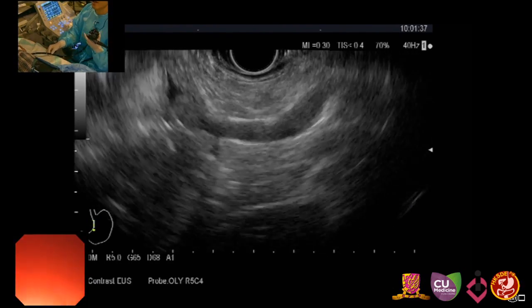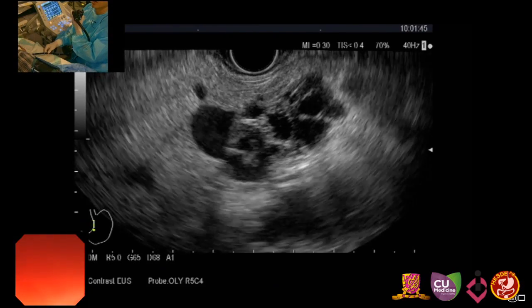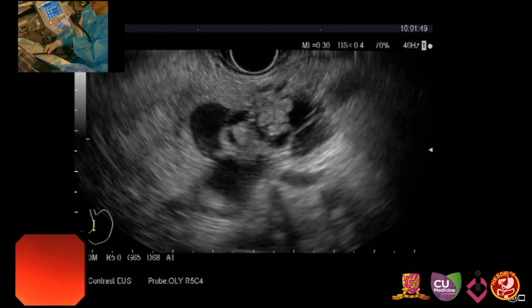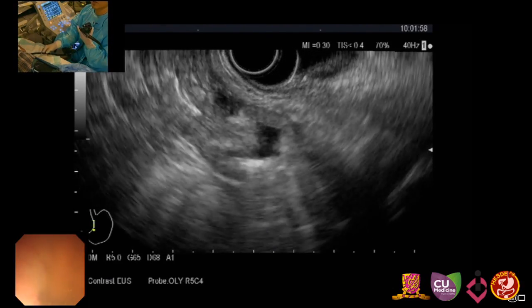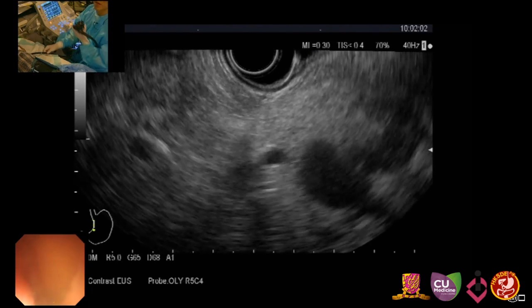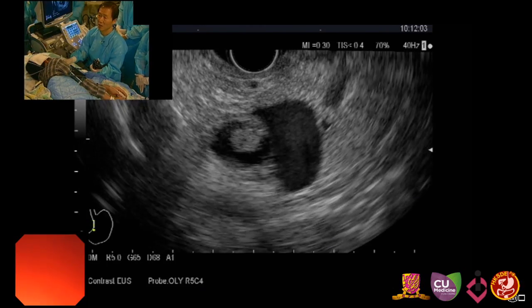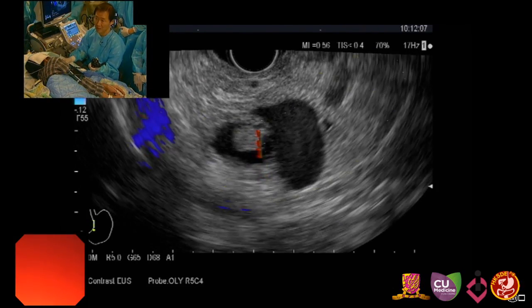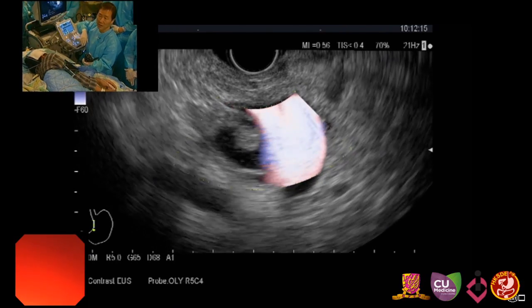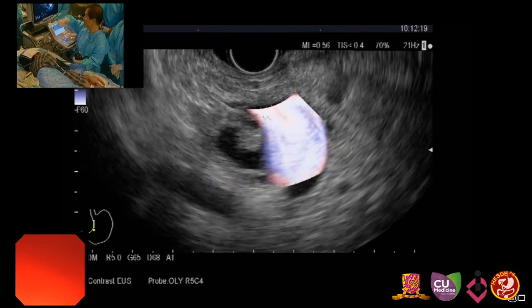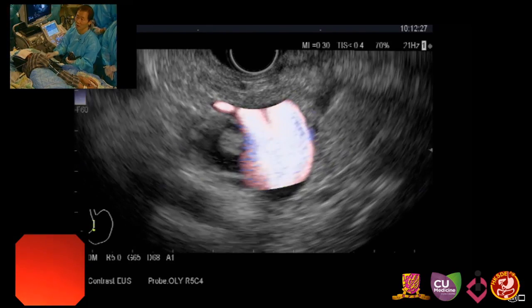When we find a lesion in the pancreas, we must think about the possibility of another lesion elsewhere. I found this large lesion here, but I will search down to the head area. If there is a multifocal lesion, the possibility of IPMN actually increases. I previously examined the body lesion, and now I've inserted my scope into the duodenal second part and I'm looking at another cystic lesion here. Very close to the portal vein — at the portal confluence area — we can see another cystic lesion showing a rather large mural nodule.